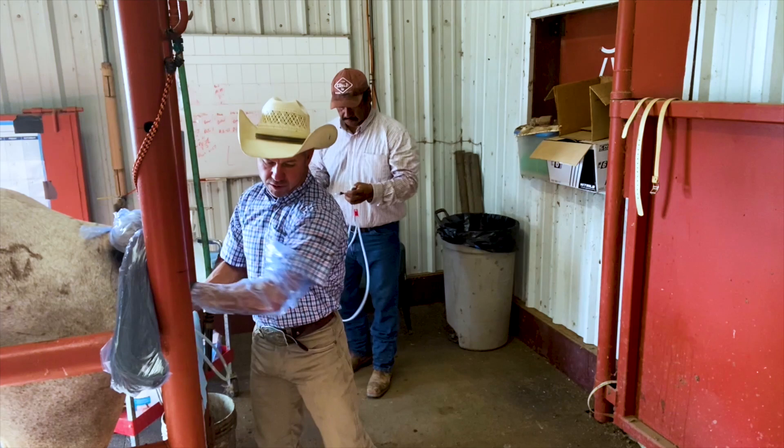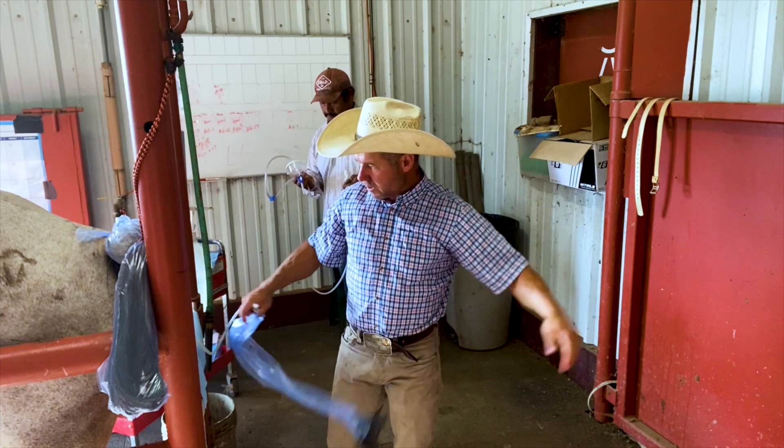Welcome to the Mendota Ranch. What we're doing today is flushing an embryo out of this mare — we hope.